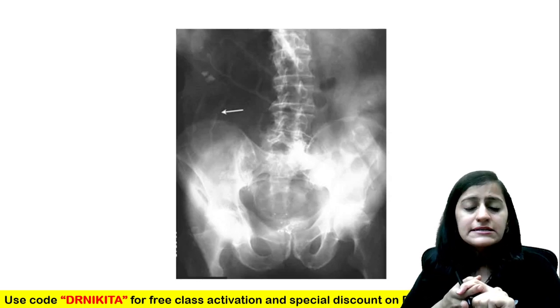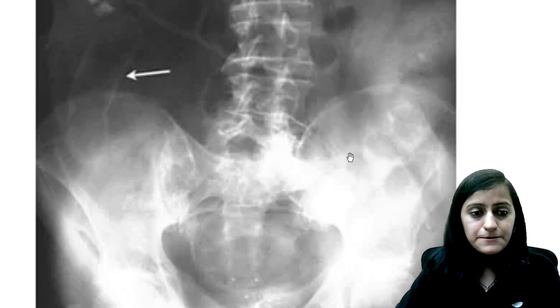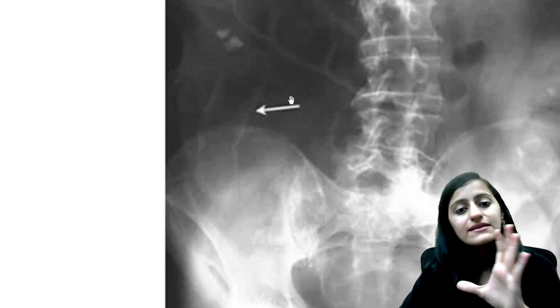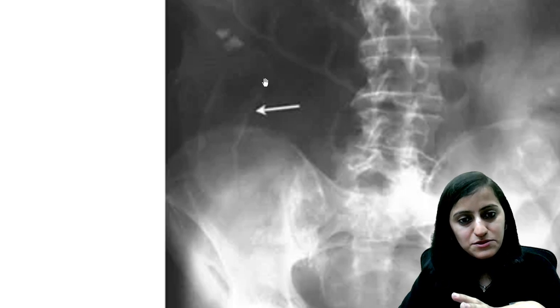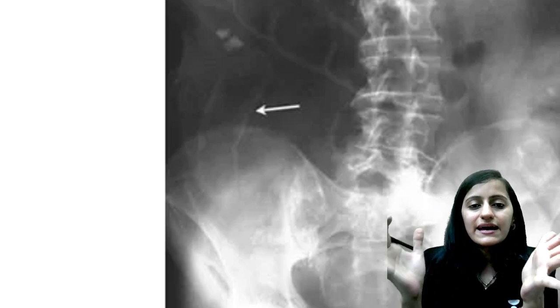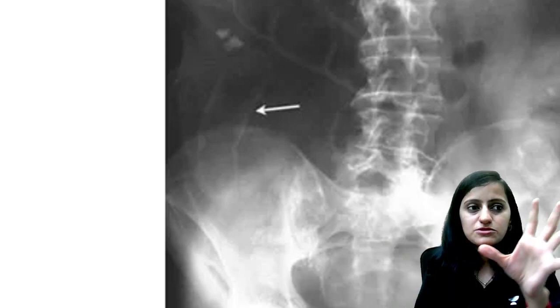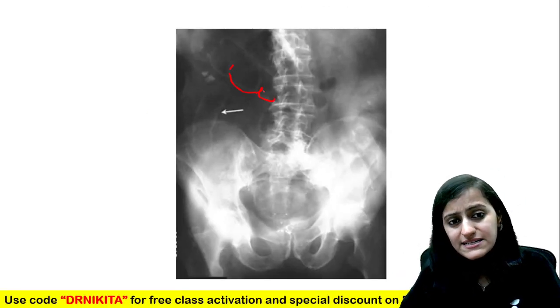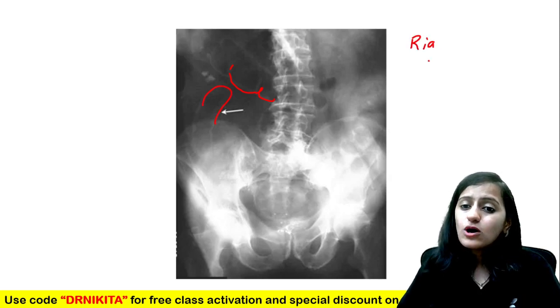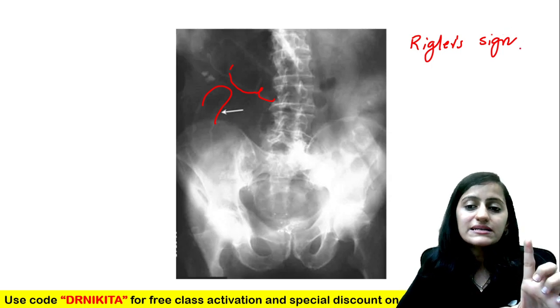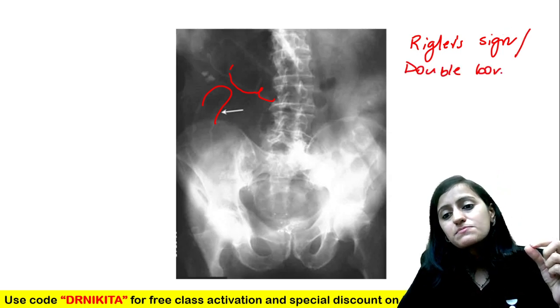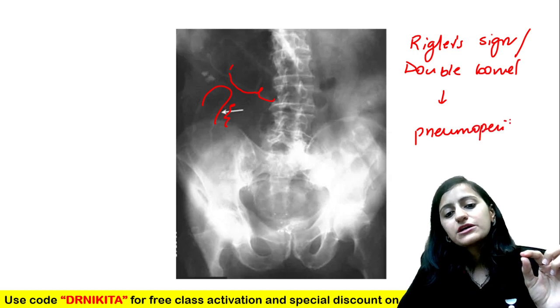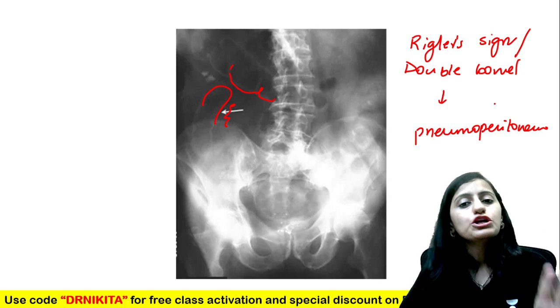In the next image, what is prominent is that you can see the bowel wall very clearly — there is air inside and also air outside the bowel loop. Air inside is black, air outside is black, and in the middle the white bowel wall stands out. Whenever you see this very distinct bowel wall appearance, this is called the Rigler sign, also known as the double bowel wall sign. This is suggestive of air outside the bowel — that is pneumoperitoneum. This is an important sign of pneumoperitoneum.